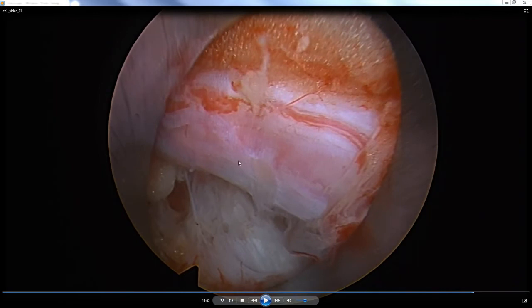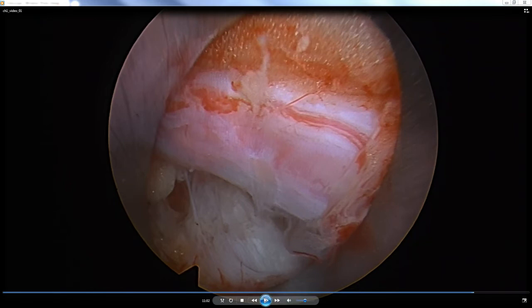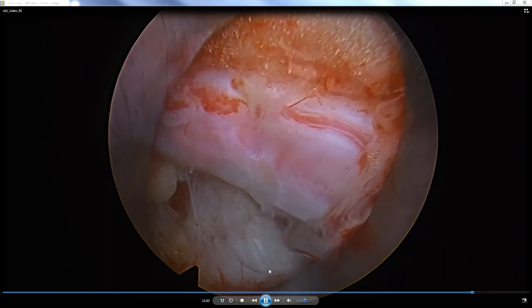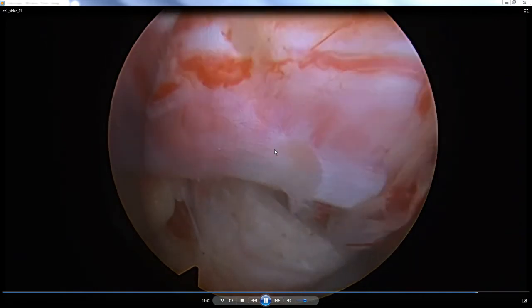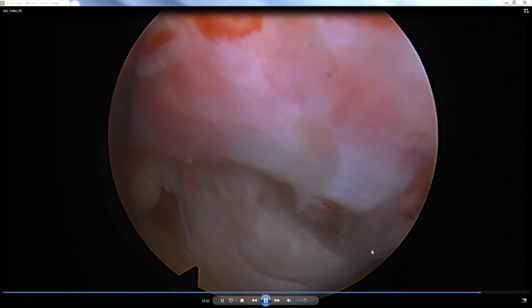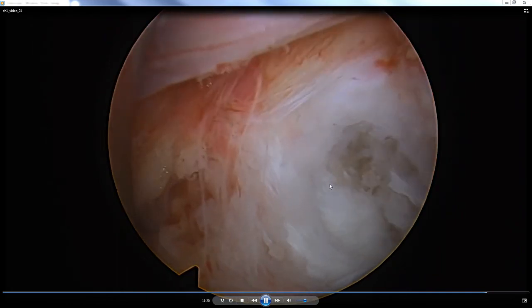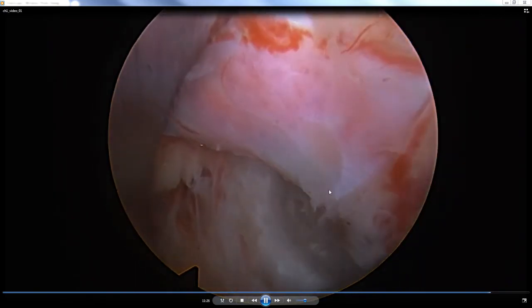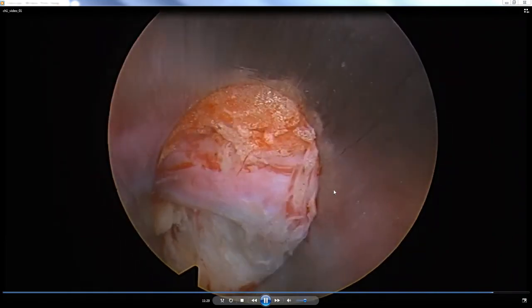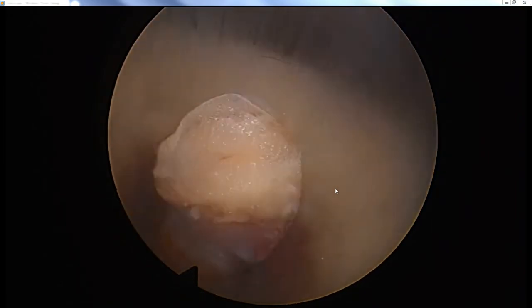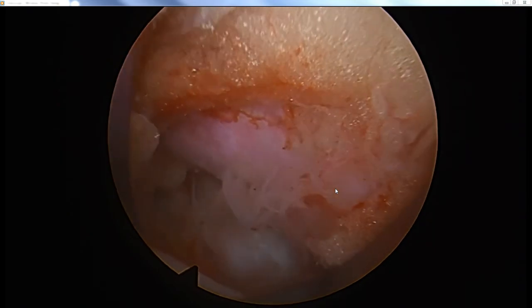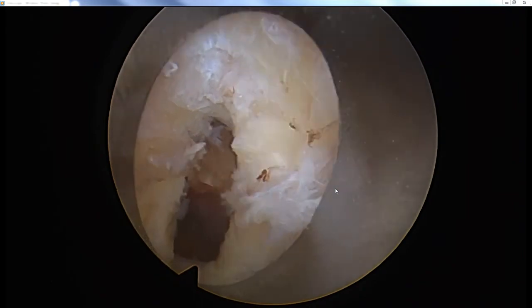This is the picture we'd like to see at the end. The S1 nerve root is clearly in view, epidural fat is the yellow tissue, and you can see what I consider inflammation along the nerve root from the previous disc herniation. You can see where the fragment of disc material was sitting just underneath the nerve root. Once we turn the cannula back to allow the nerve root to return to its natural location, you can see how the nerve root is now pulsatile — whereas previously it didn't move with heart rate — indicating that adhesions on the undersurface of the nerve root have been freed up. Epidural fat is now starting to creep back in, and I think that barrier of fat returning is probably one of the things the body does to decrease inflammation in the nerve root.